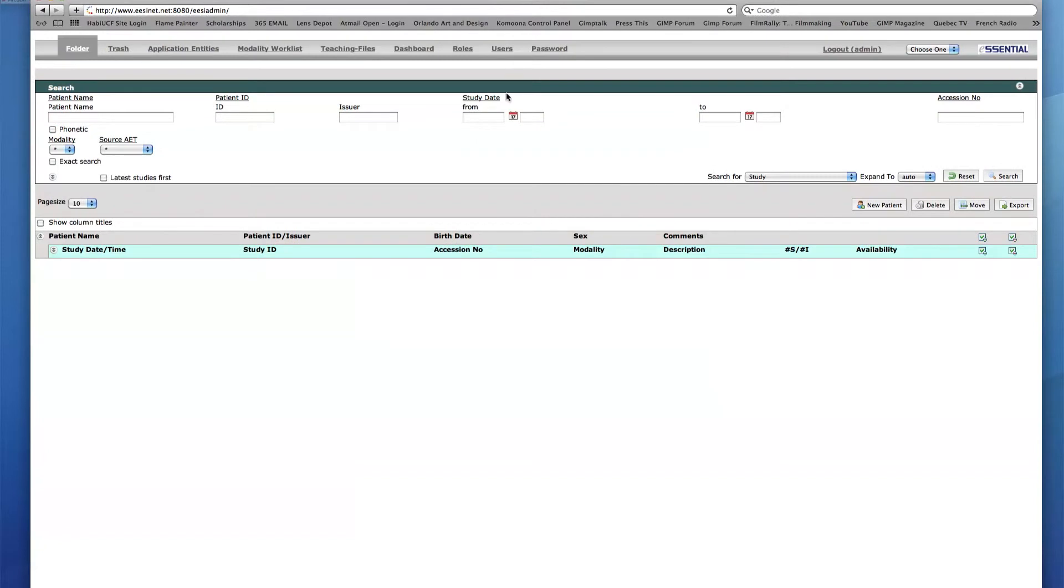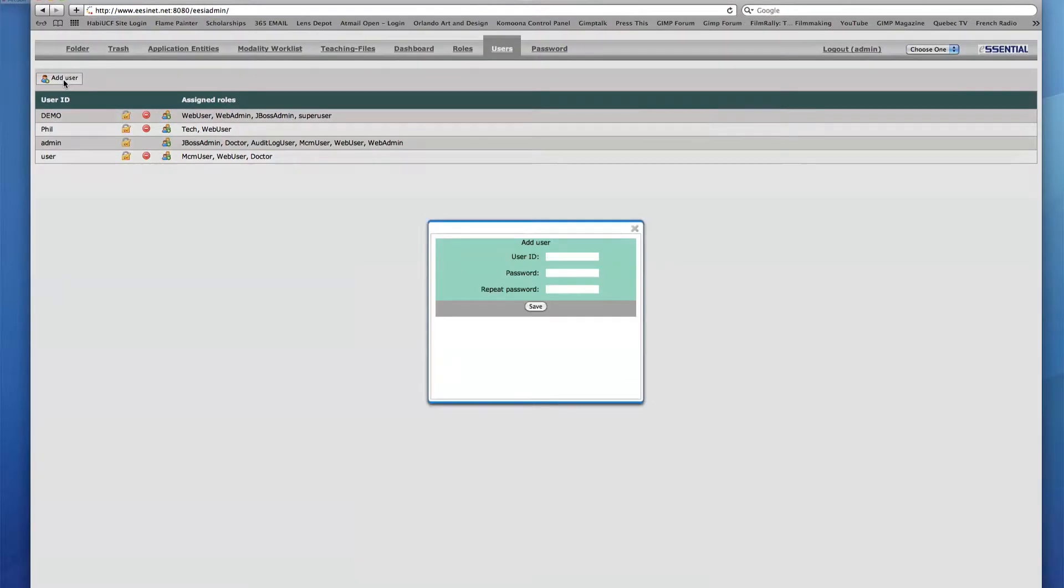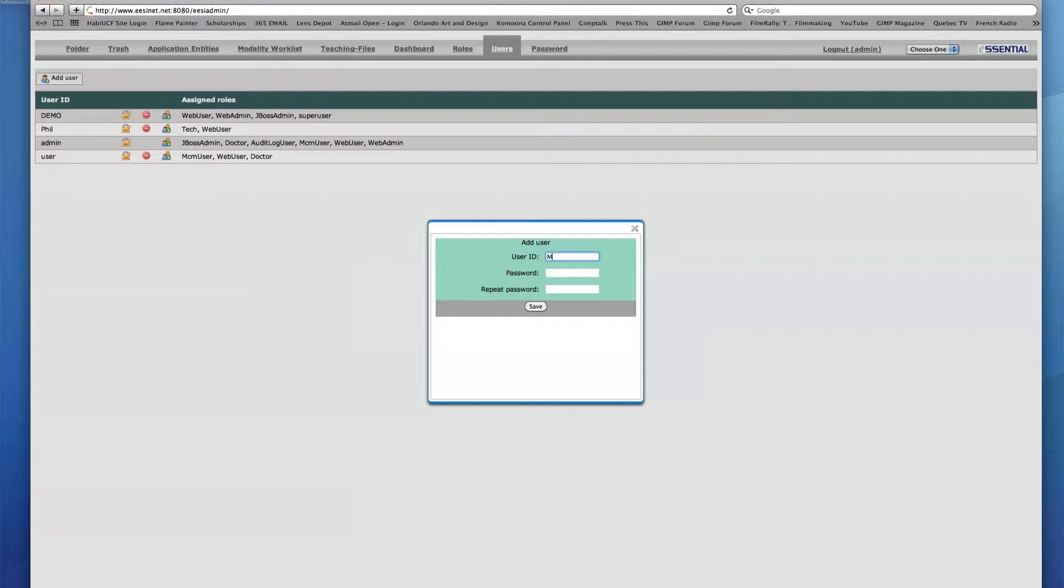Starting in the Users tab, a new user can be created by clicking the Add User icon in the top left corner. A dialog box appears with three empty fields including User ID, Password, and Repeat Password. I will add a new user called Mike Tech, along with a password for this user, and click Save.